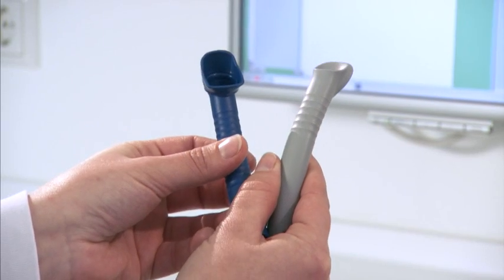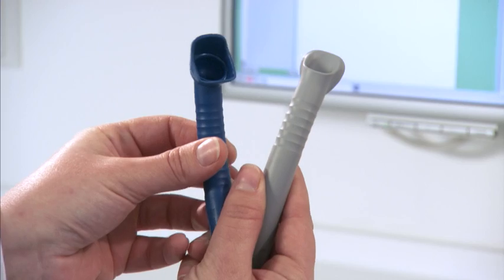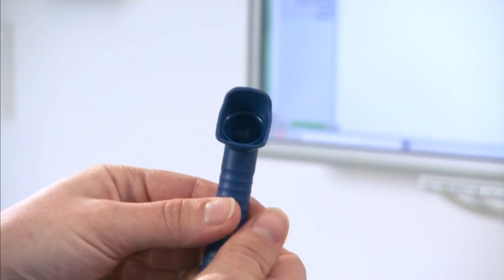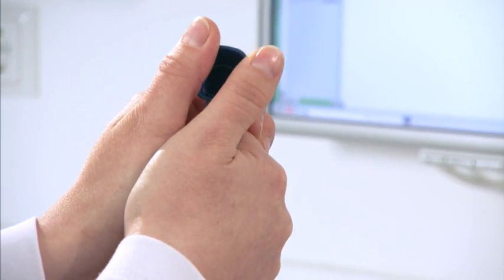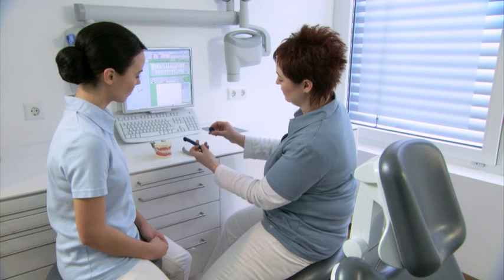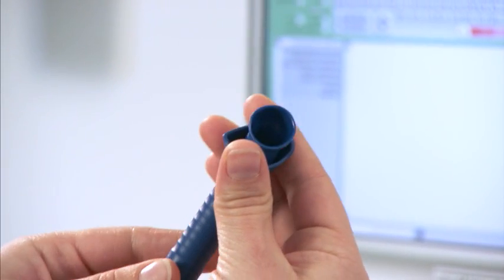A direct visual comparison of the Prophylaxis cannula and Universal cannula clearly shows the difference in shape. The protective shield for the cannula is easily removed for cleaning, disinfection and sterilization, and is effortlessly clicked on for treatment.